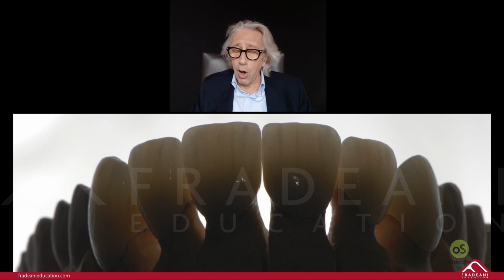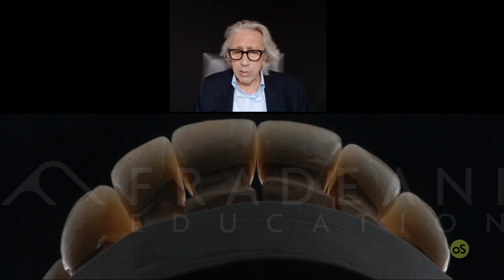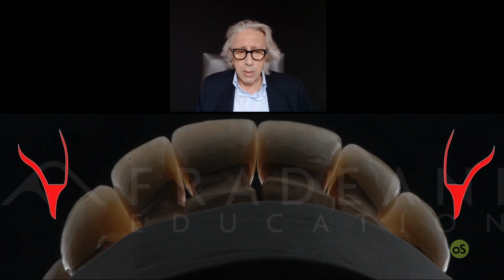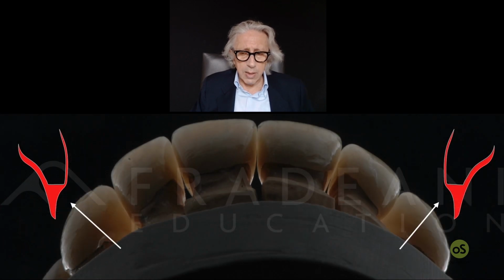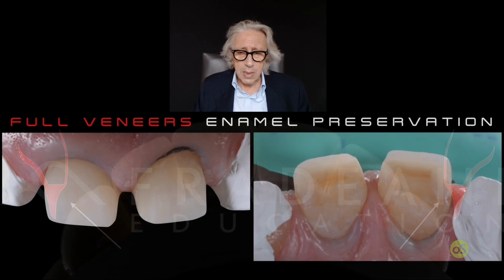Is it a risky case? Of course it's risky. All the time it's risky. But you have to do your best. So that is why what we've done is to create this kind of situation. This is exactly the abutment shortening. We try to thicken it, the external part and internal part, in a monolithic way. We just left some space for layering there. It's up to you. You can also have less risk going just monolithic and just coloring over. It could be a good idea too, to avoid any kind of chipping.